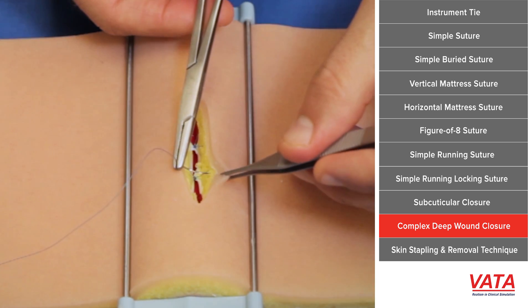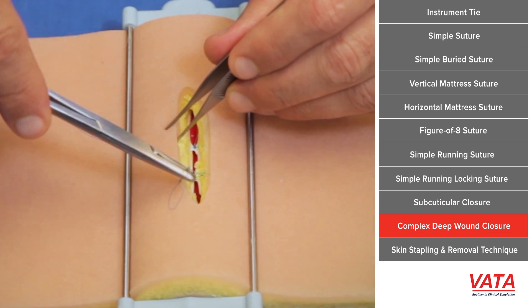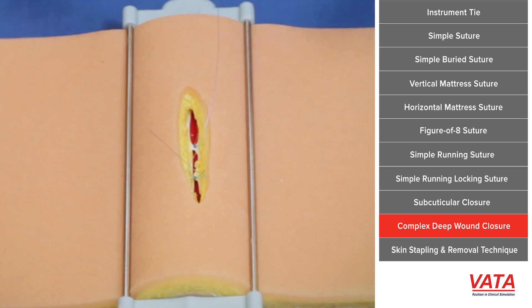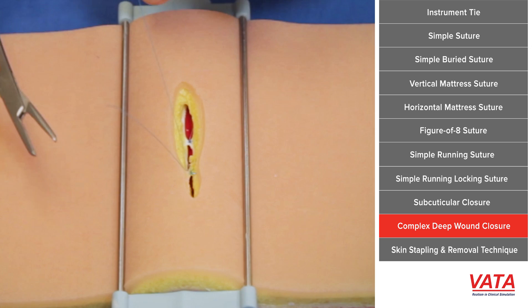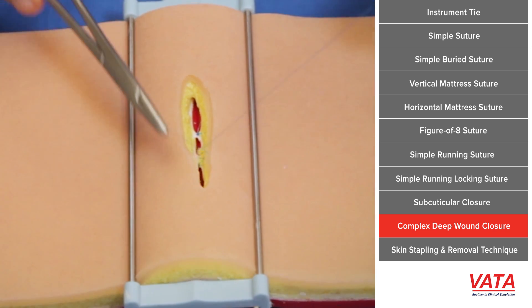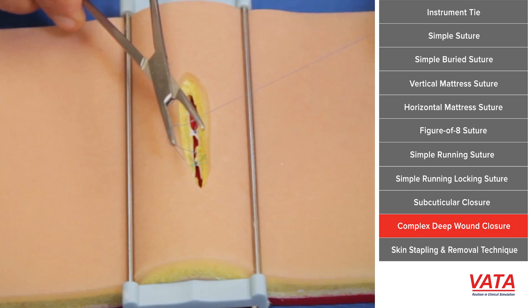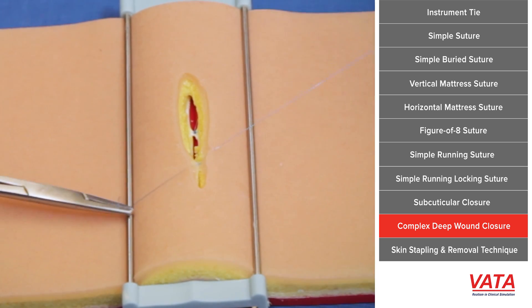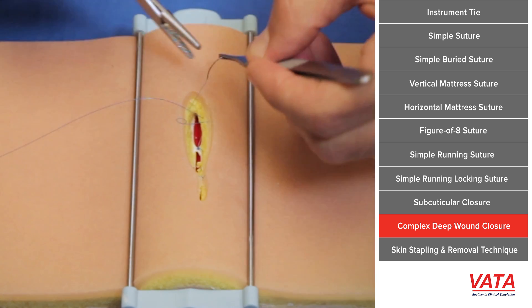Once the fascia is closed, you have a decision to make. You can go right to the dermis, or in some parts of the body there's what's called Scarpa's fascia, so you could potentially close another layer. I'm going to close the deep dermis, and it's going to include some of that fatty tissue — which would theoretically be like a Scarpa's fascia. But the dermis is the strength here. This is a buried knot because this is the next layer of closure — we started deep and went superficial. You can see there is some tension on this wound, and this type of model is realistic. You can set the tension as much as you want, and as you advance you want to add more tension to see how good your knots and suturing are.